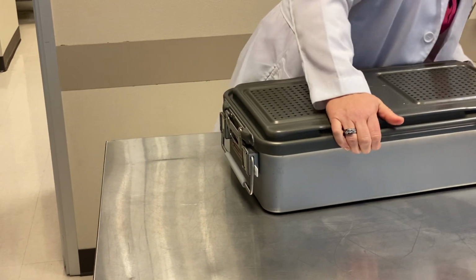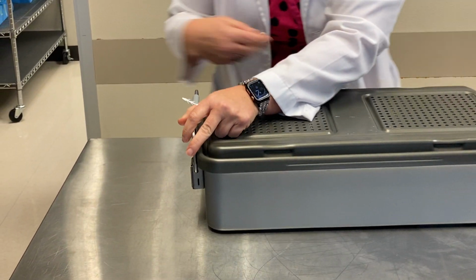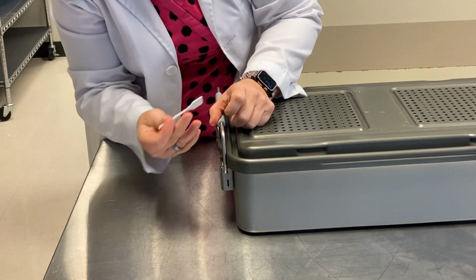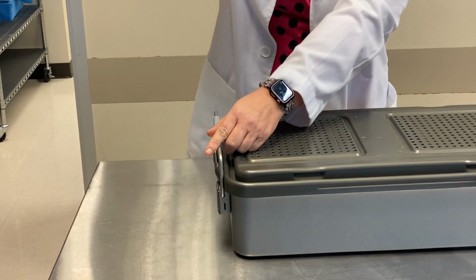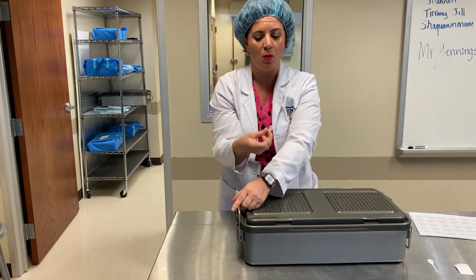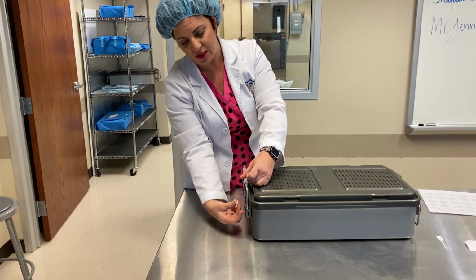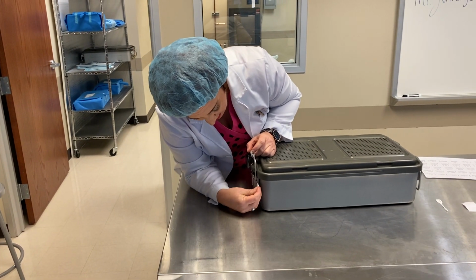And the same thing we will do over here. There's usually only a slot on one side. There's the slot here. We're gonna put that arrow in, and you wanna make sure when you put it in that the chemical integrator dot is viewable. So you wouldn't wanna put it in with it against the tray. It will not be seen easily.